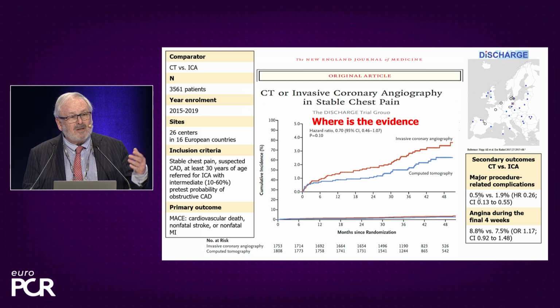But in the group who had the CTA before, to make the planning, to become aware of the problem before doing catheterization and PCI, it was only 0.5%. That means a 75% reduction. That, I can tell you, Jean, will be repeated and repeated until the community becomes convinced.